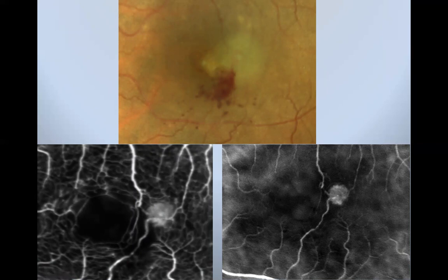Of course, ICG is a really great tool for RAP because part of the problem with fluorescein angiography identifying RAP lesions is they leak right off the bat. So you really can't see where it connects or where that lesion is being fed. On ICG, though, because the dye doesn't leak out of neovascular vessels, you can actually see it very well. You can see the neovascular complex, and you can see the retinal blood vessel that flows back from it here, and even a connection up above it here, and maybe even a third connection over here as well. So ICG is really great for that.